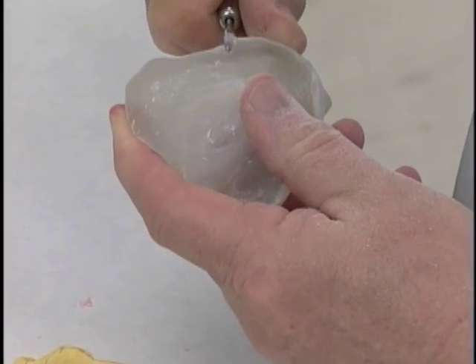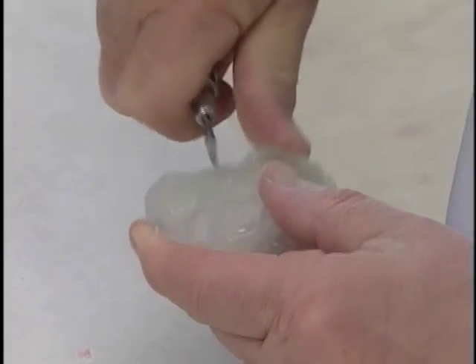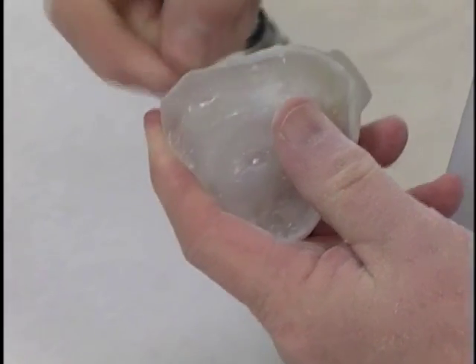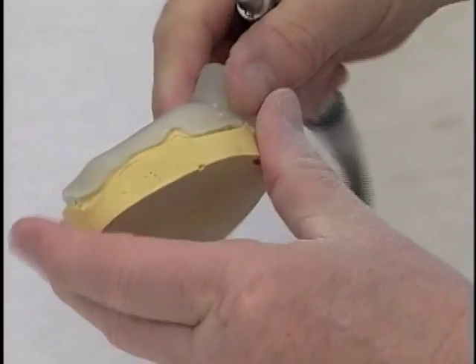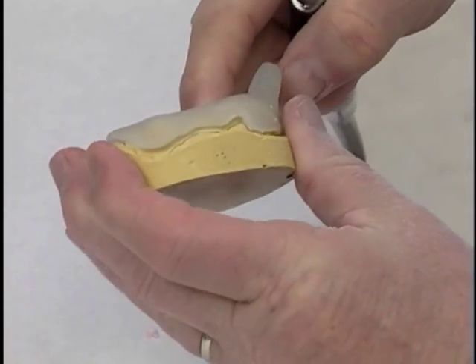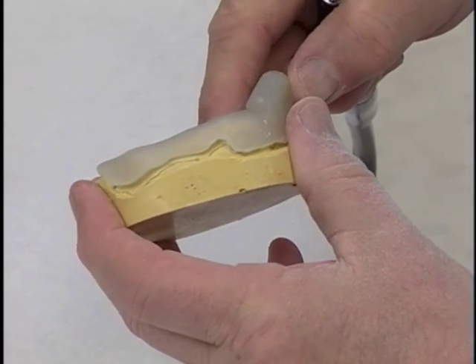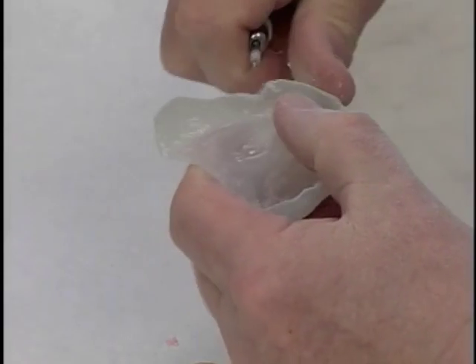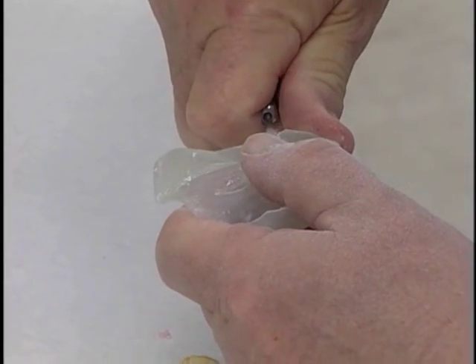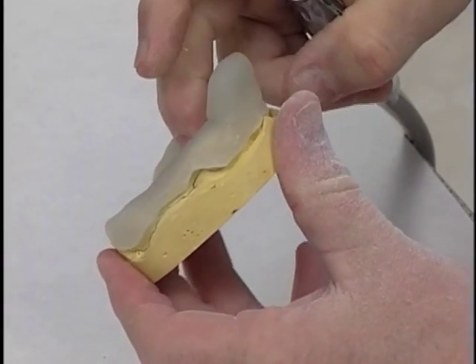And the buccal frenum, we want that notch quite V'd out so it provides space or room for the buccal frenum to work anterior, posteriorly, or vertically. We need a little bit more on the anterior portion of that notch. And that pretty well has that notch cleared.